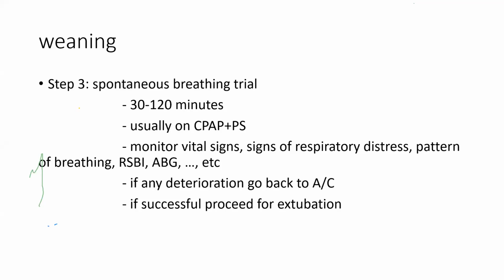So during the spontaneous breathing trial, you monitor the vital signs, the signs of respiratory distress, his pattern of breathing, something called the rapid shallow breathing index, which has to do with the patient's tidal volume and respiratory rate. You take an ABG. If any deterioration happens during the spontaneous breathing trial, then you go back to assist control, which is volume or pressure control, the mode he was on before this trial. But if it is successful, then you can proceed to extubation now.